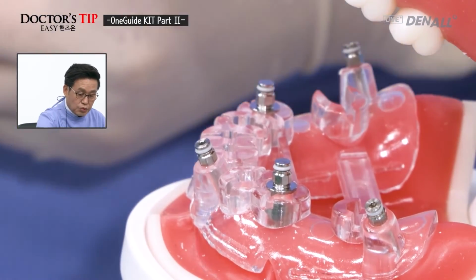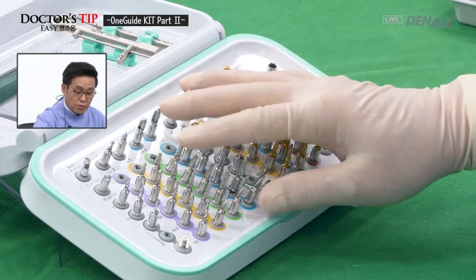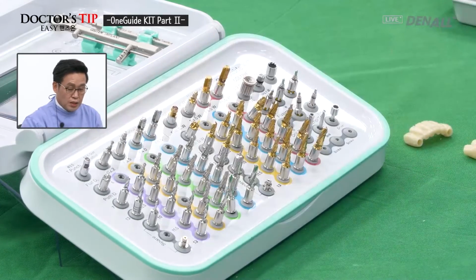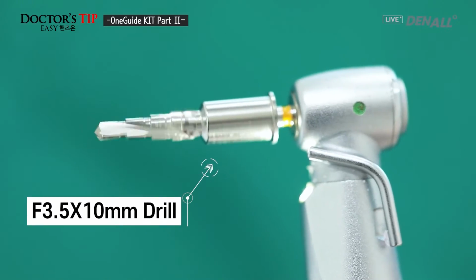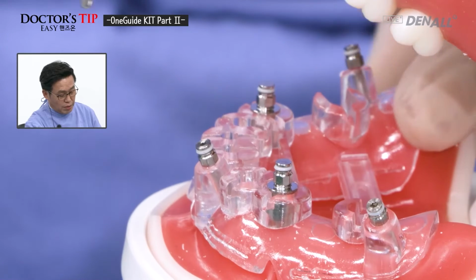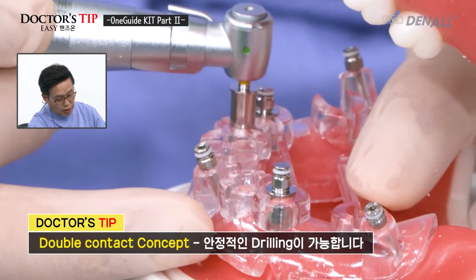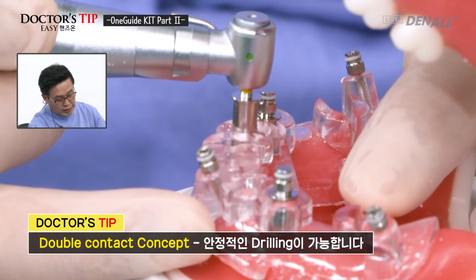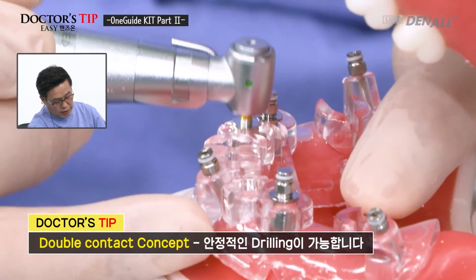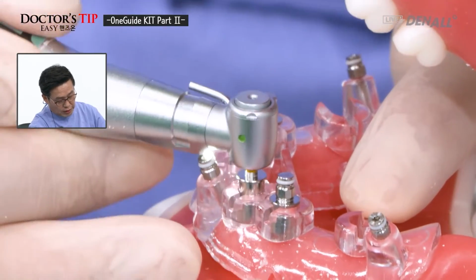Initial drill 3.5, this is short, and then I'm going to place 4.0 by 10 millimeter, so I'm going to choose 3.5 by 10 millimeter drill. As mentioned before, double contact concept. It is in contact with the bone as well as the template, and therefore 10 millimeter hole is made full length drilling.